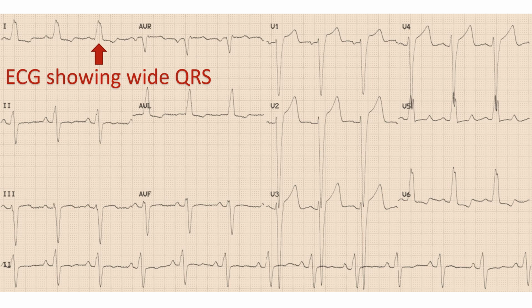and not always accurate. More common surrogate of dyssynchrony, which is mentioned as the criteria for implantation of CRT, is the width of QRS complex on the ECG. QRS complex represents the electrical activation of the ventricles. So, if the QRS is widened, it is presumed that there is dyssynchrony.